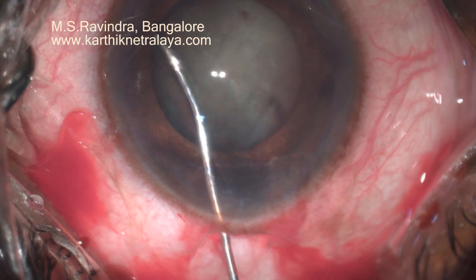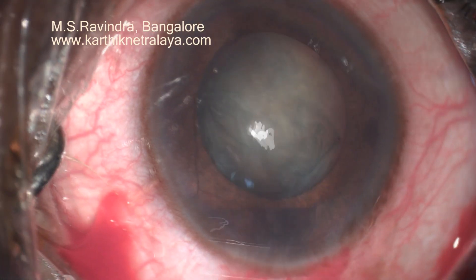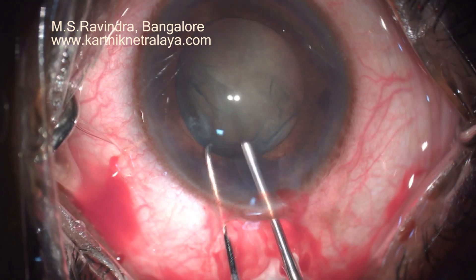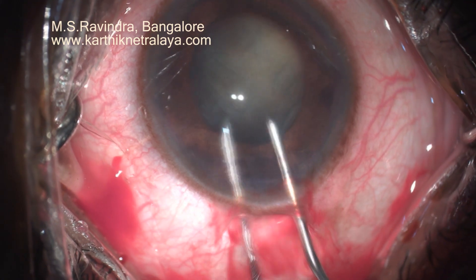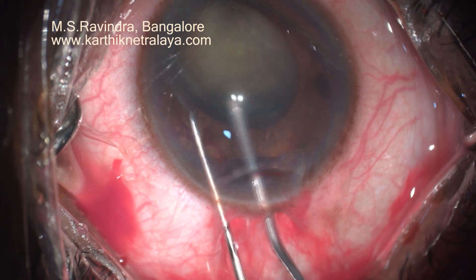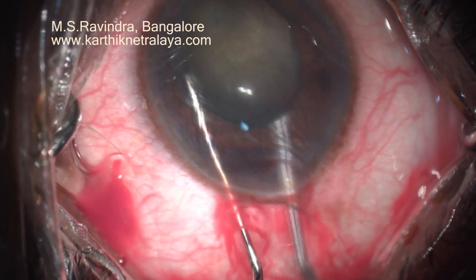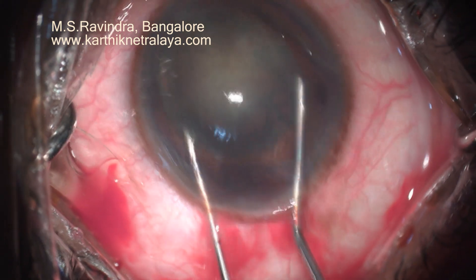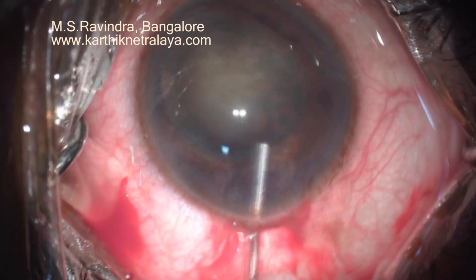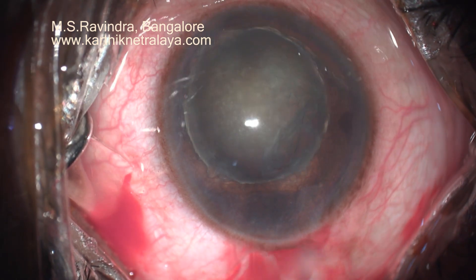Topical anesthesia now supplemented with a little bit of 1% lignocaine in front of the iris and very gently behind the iris. The nucleus is rotated. Surprisingly, it is not a very large nucleus as I had predicted, but it is extremely hard. It will not come out through the tunnel that I have created because of its thickness and hardness. It is not malleable.